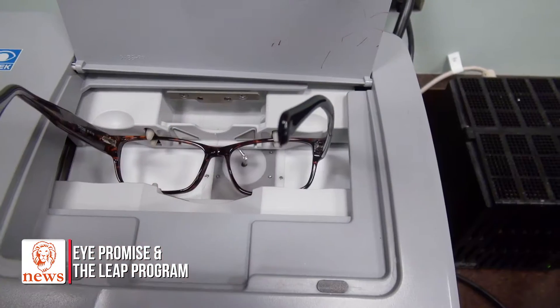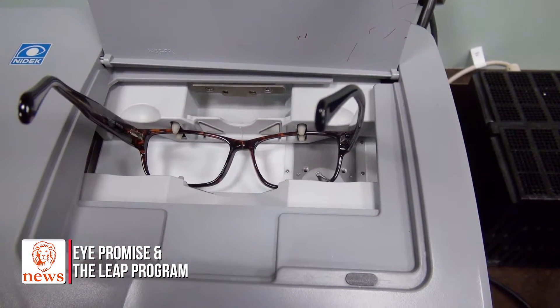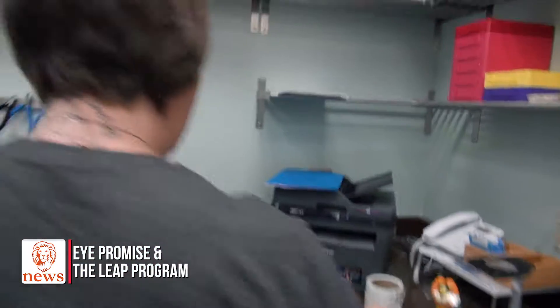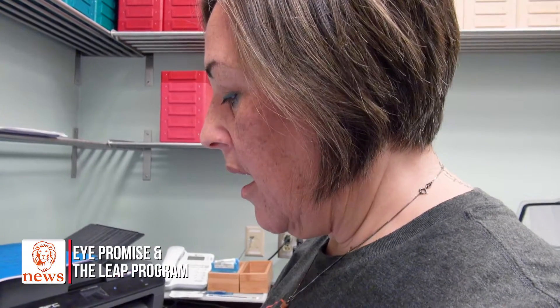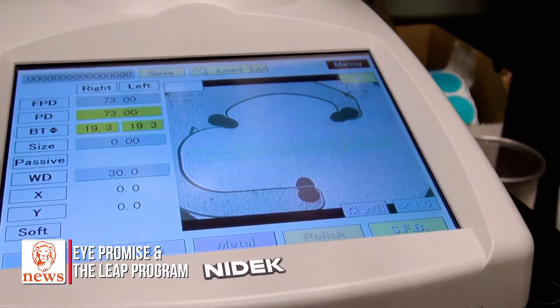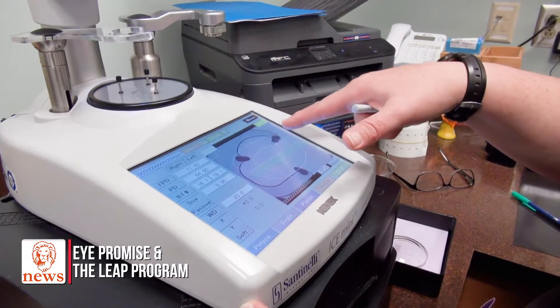We've spotted our lenses, so now we're going to trace the glasses to get the correct shape when we cut out our lenses. The information we enter into our blocker after the frame is traced includes the prescription information, the PD, seg height if it's a bifocal, the type of material we're working with, and the type of frame we're using.